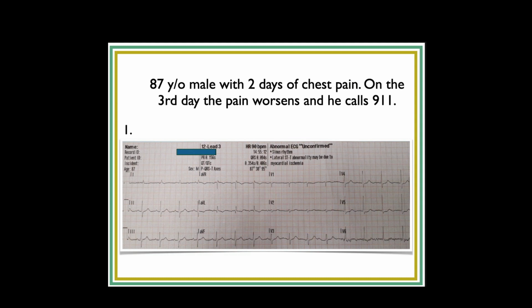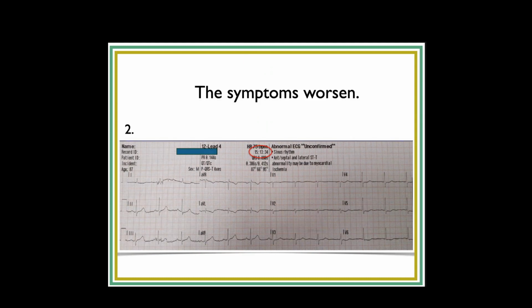And again, it's really subtle, so you have to look for it. So here's a little bit of ST depression, and there's the T wave, okay? So certainly no cath lab criteria, that's for sure. So there's our time. The symptoms got worse, and it looks like it was a fairly long transport, so we're about 17 to 18 minutes on.